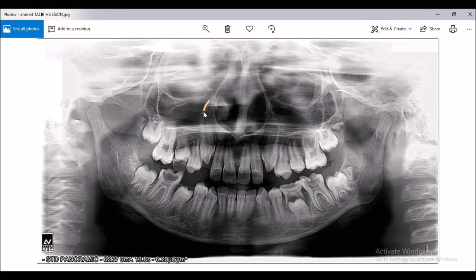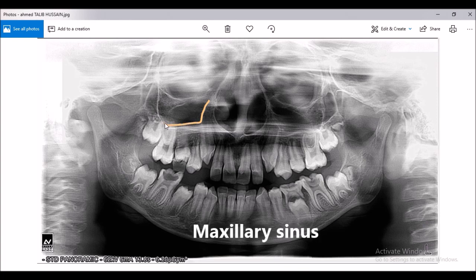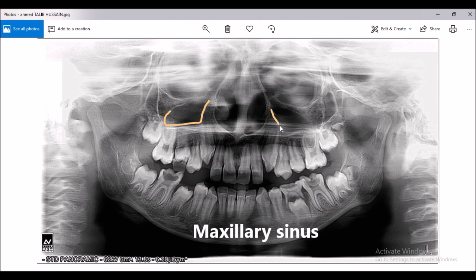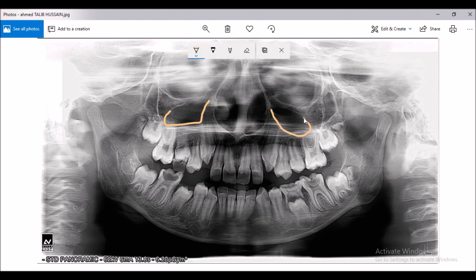This area is the maxillary sinus on the right side, and this is the maxillary sinus on the left side.